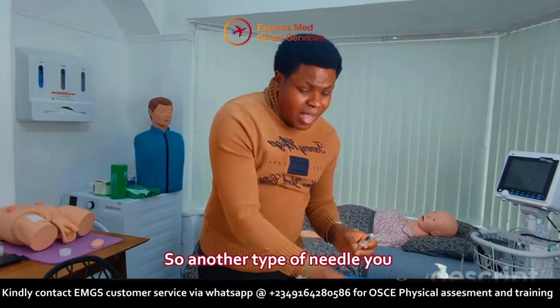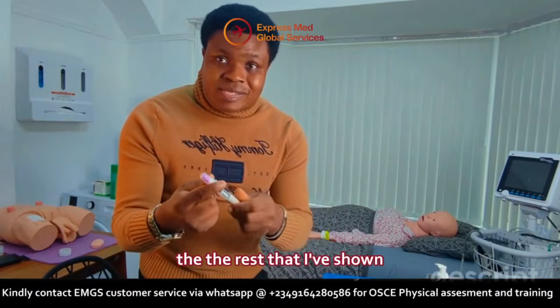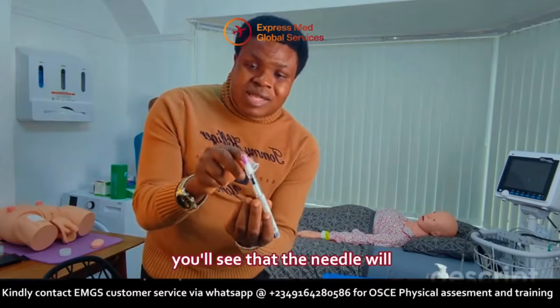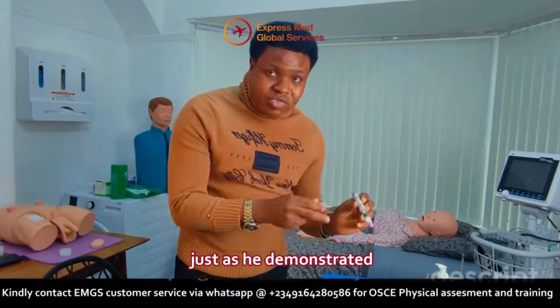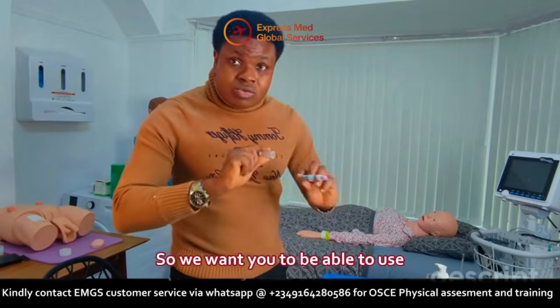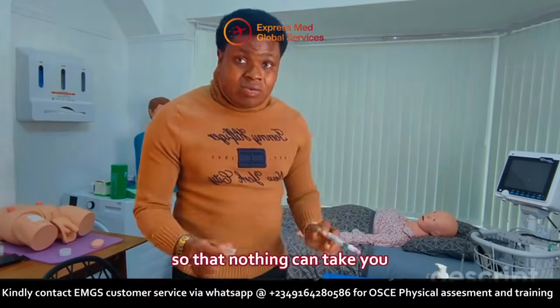So another type of needle you can also find is this. This is also different from the rest that I have shown you so far. If you look at this very well, you see that the needle will pop up. So you just need to go ahead and administer after you are primed, just as he demonstrated. So please take note of that. At EMGS OSCE, we don't want to hear story. We want you to be able to use all the equipment and get familiarized with everything that can come so that nothing can take you unaware.